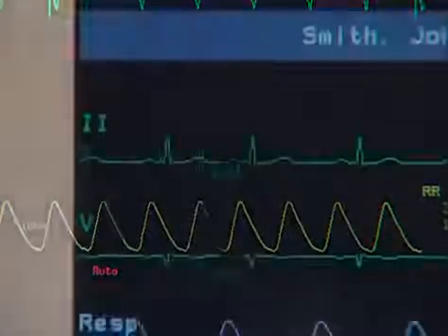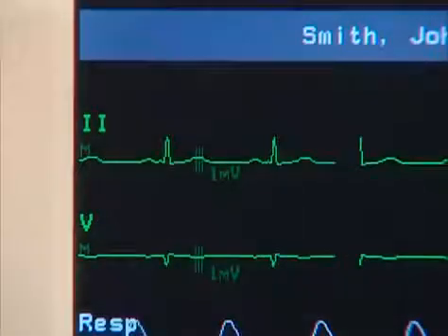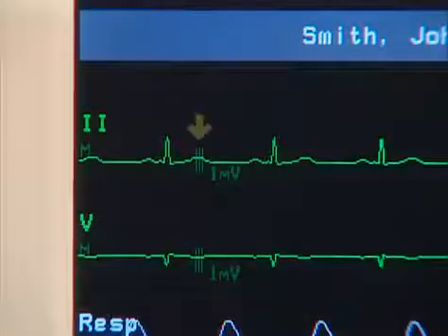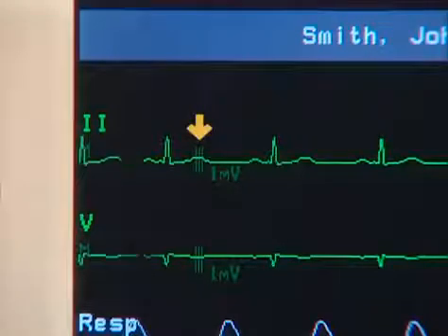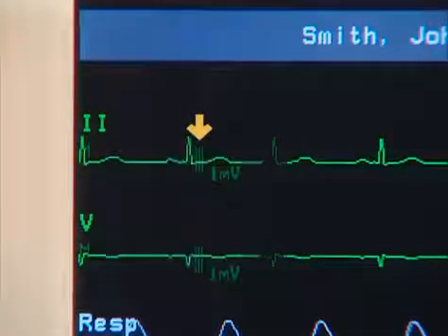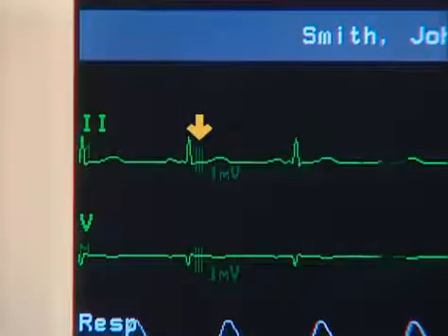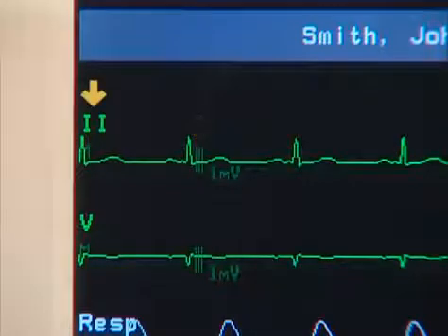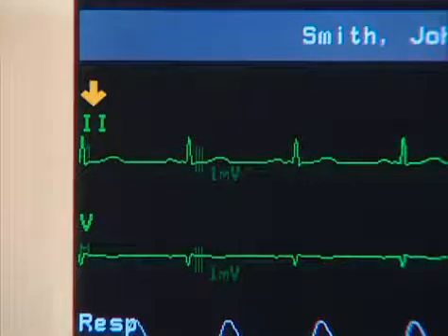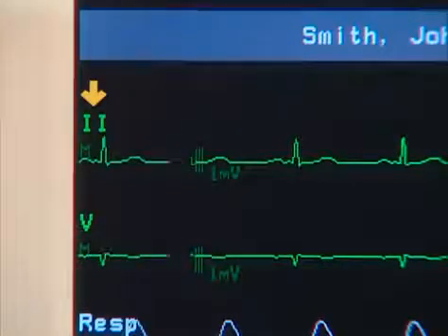A closer look at the wave reveals some additional information. This bar signifies 1 millivolt, allowing you to easily note the voltages or amplitude of the ECG. This label indicates that the monitor is displaying lead 2.